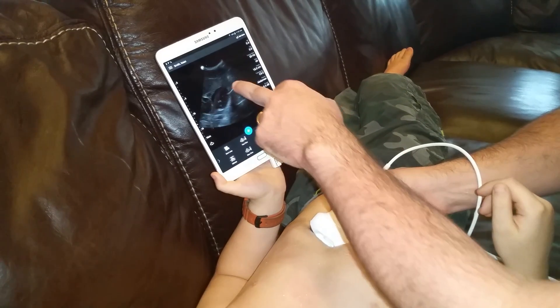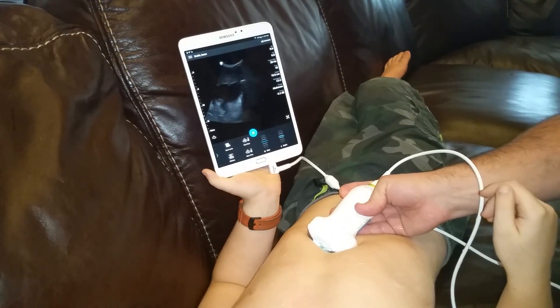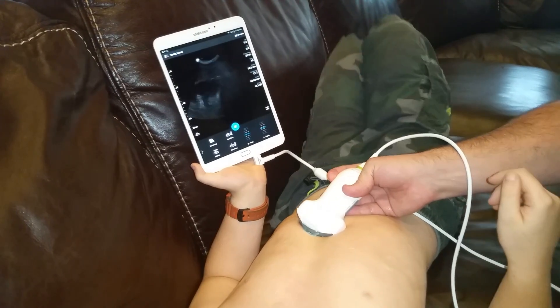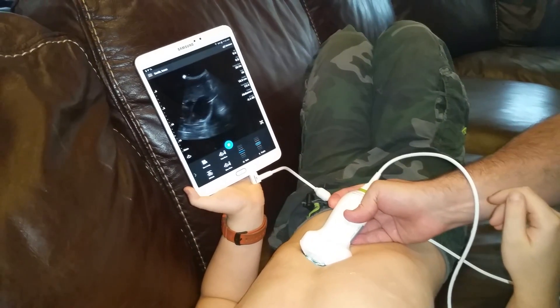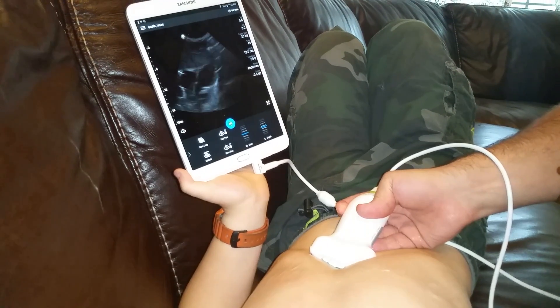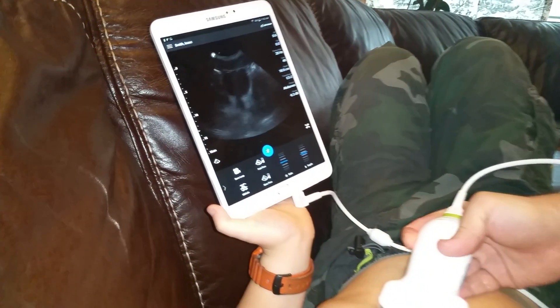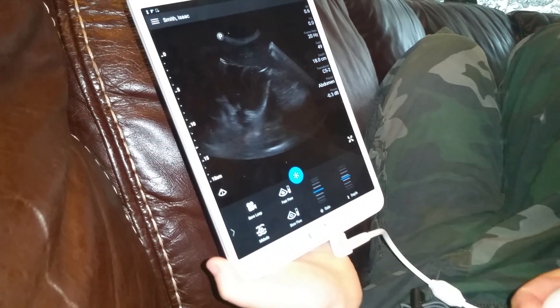Right there you can see the left ventricle, and the right ventricle is coming into view. If you have your patient bend their knees, that can help relax the belly a little bit and bring the picture into better view. Then ask them to take a deep breath and hold it — that should help you focus a little better as well.